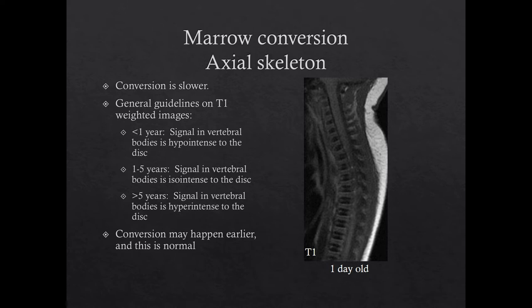This is a general guideline for marrow signal in the spine. In children less than one year, the vertebral bodies are typically hypo-intense to the adjacent disc on T1-weighted images. In children between one and five, the vertebral bodies and discs are iso-intense. In children greater than five, the vertebral bodies are hyper-intense to the adjacent disc. However, marrow conversion is often seen earlier than this typical guideline, and this is normal.